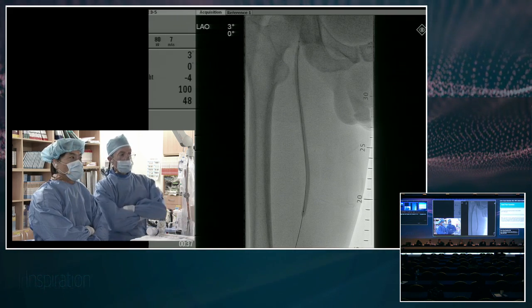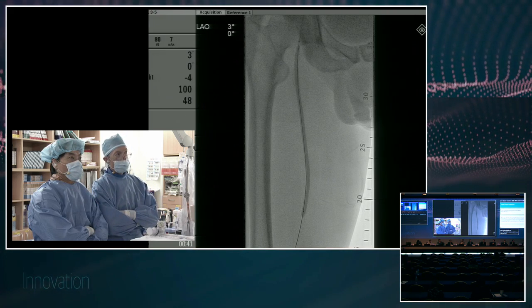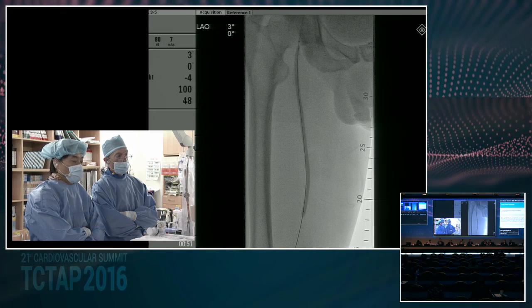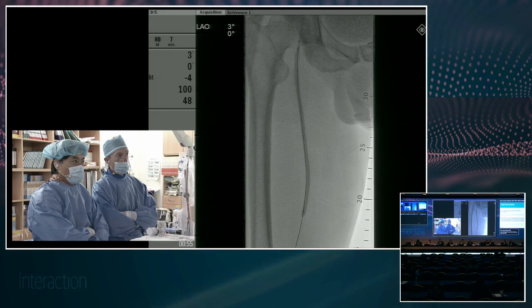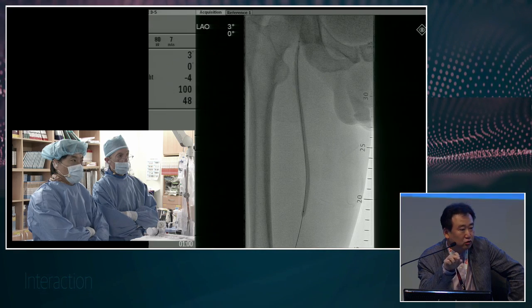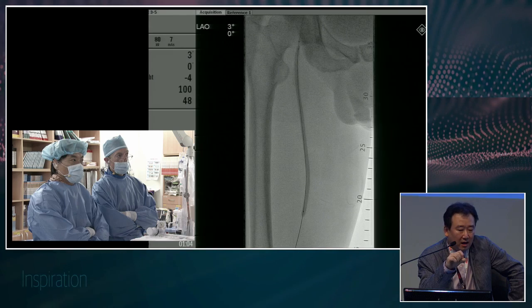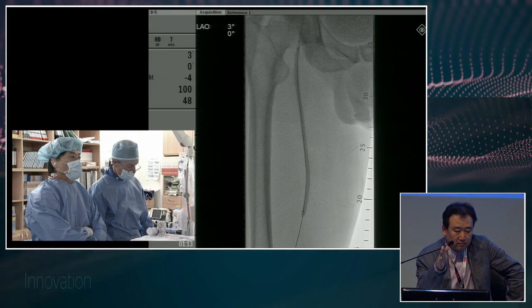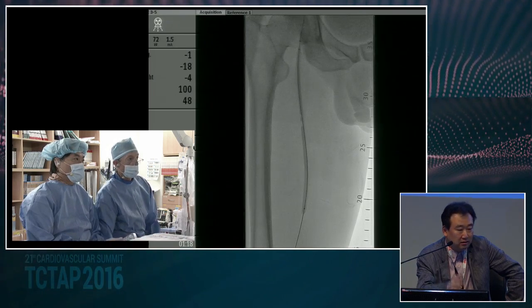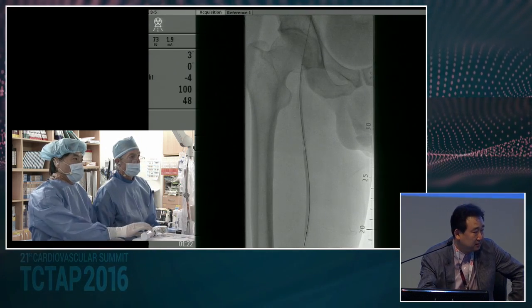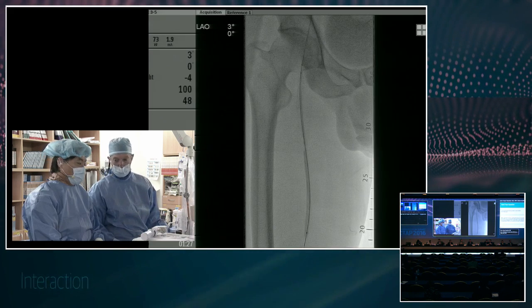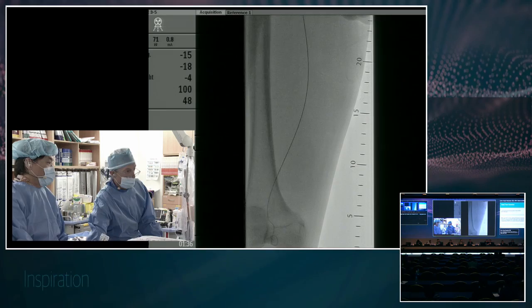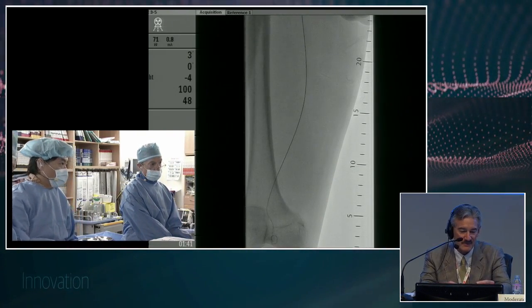Would someone do bare metal or drug-eluting stents for the entire occlusion? The subintimal re-entry point is very close to the in-stent restenosis portion, which is very prone to restenosis or acute closure, so we probably cannot avoid putting stents in. However, it's a very long segment occlusion, so drug-eluting stents for the whole length should be good. My concern is that the proximal stent occlusion seemed very fibrotic and hard to cross — that would predict not a great outcome with balloon angioplasty and high risk of recurrence at the proximal end.